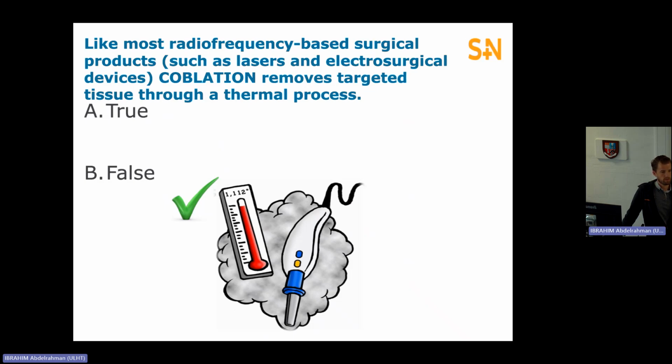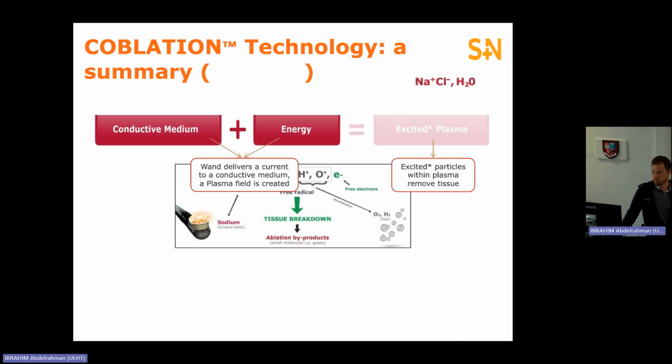So the energy is not going directly into the tissue. It's going into the saline, and that's where a lot of the heat and energy is dissipated. So it's a chemically driven process and not a heat driven one.